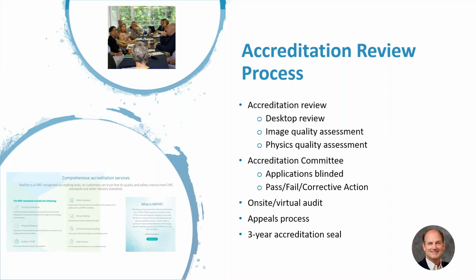Sure, thank you. So the accreditation review process, of course, number one always starts with reviewing the standards. Once you've decided to move forward, then we have a portal where you will do everything. You'll follow the standards. You'll have questions to answer. You'll have documents to upload. You'll have, of course, your clinical studies to upload, as well as your phantoms and physics to upload. Once everything is completed, then we move into that accreditation review process.